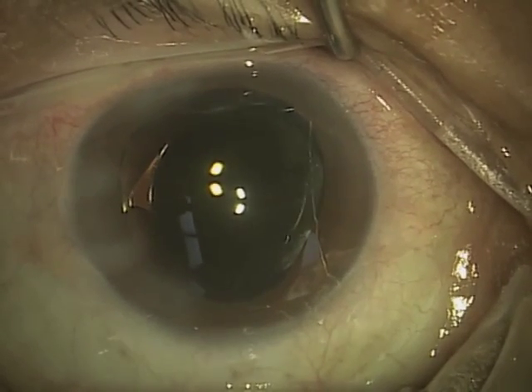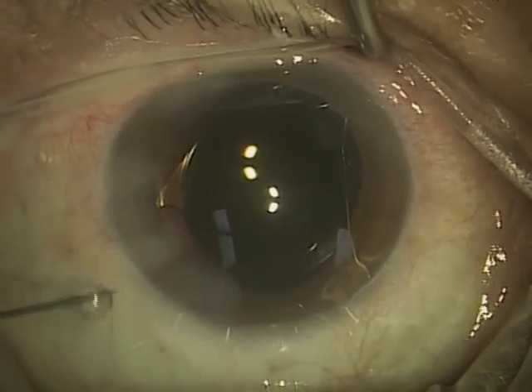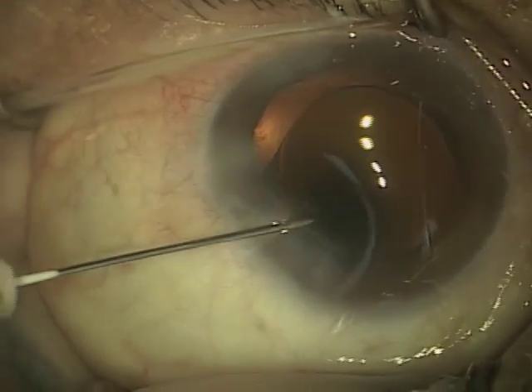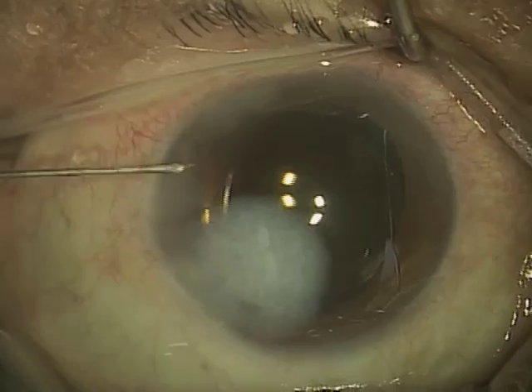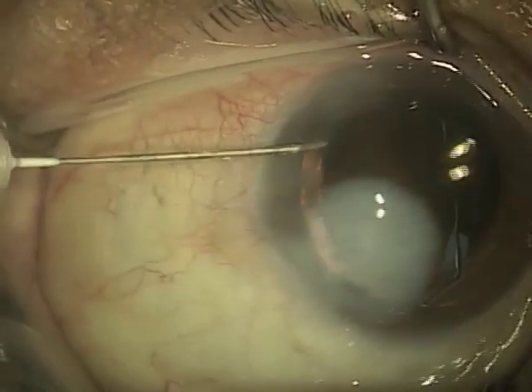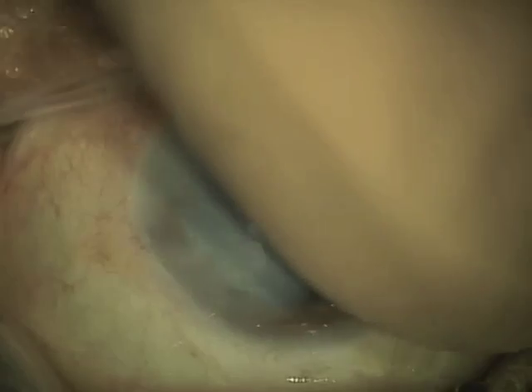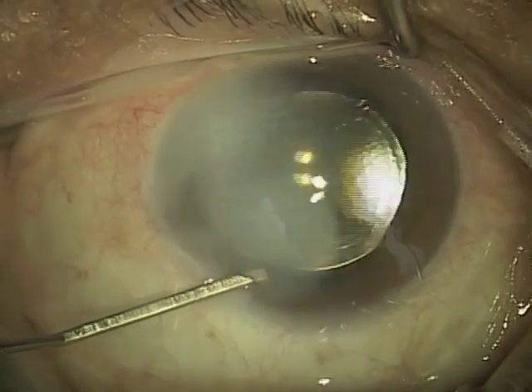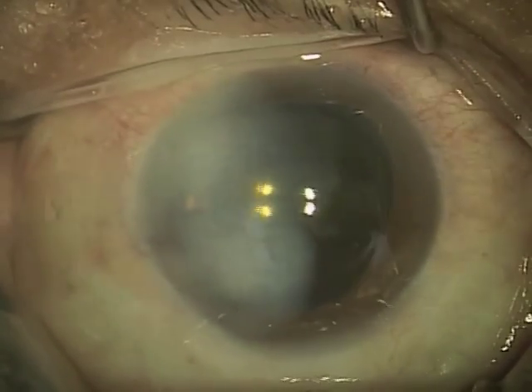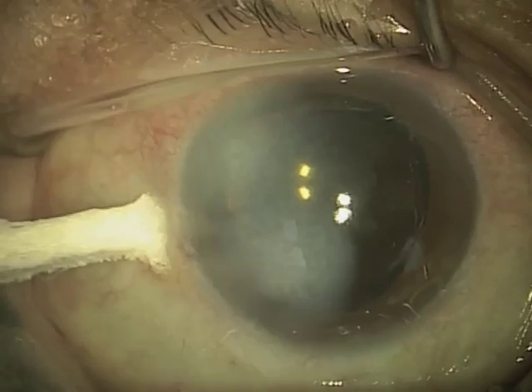Now we're pretty much done with the surgery. What I'm going to do before I'm completely done is inject an antibiotic solution into the corneal stroma — actually injecting it into the cornea itself, which whitens the cornea. It's not pretty, but this will go away in the next 24 hours. This helps close the incision and gives this patient some protection from infection. The first 24 to 48 hours are absolutely critical.